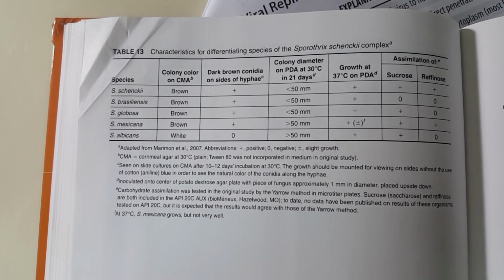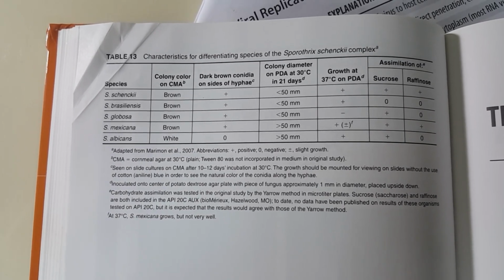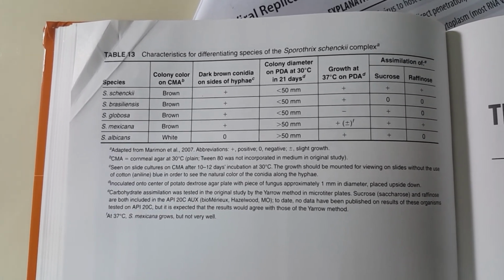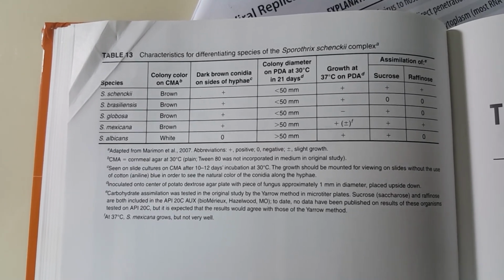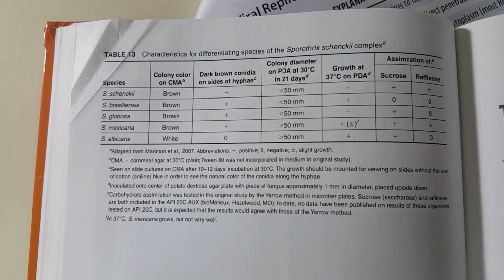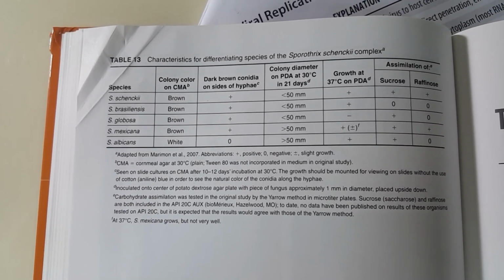S. schenckii can grow on PDA at 37 degrees centigrade, and sucrose and raffinose are both positive, while S. brasiliensis has both sucrose and raffinose negative, and only S. mexicana has a property just like S. schenckii, with assimilation of sucrose and raffinose positive.